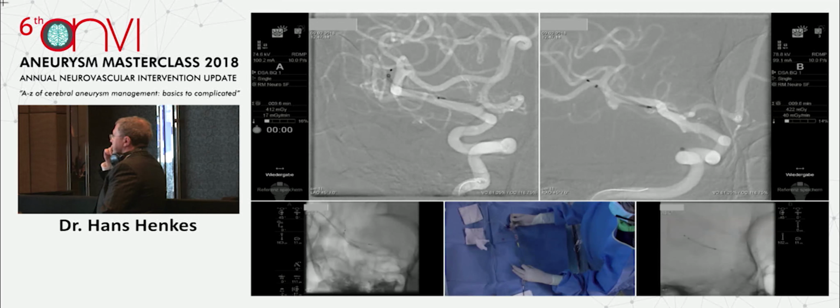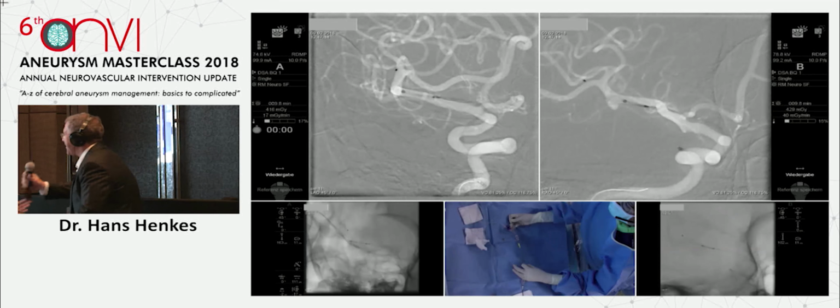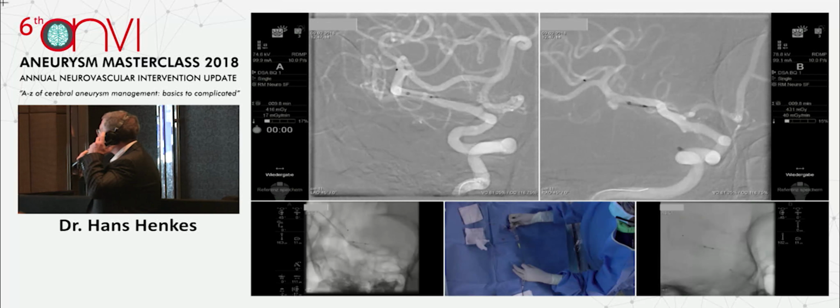The P64 you get, there are two types, aren't there? One with the distal wire and one without the distal wire. Am I correct? The one without the wire is no longer available. It's no longer manufactured.